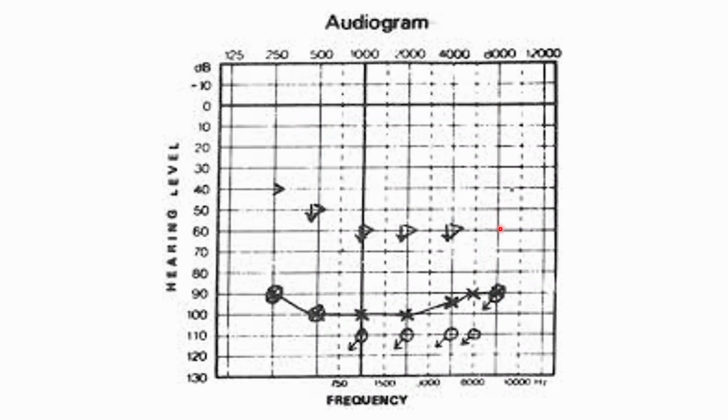Okay, so there is another graph. If we look closely, there is no response, which is shown by the downward arrows on the right side in air conduction and in bone conduction on left side. So the patient's hearing is absent when they are not able to hear any sound via the air conduction headphones or the bone vibrator. Then you have to label it with downward, showing that there is no response.